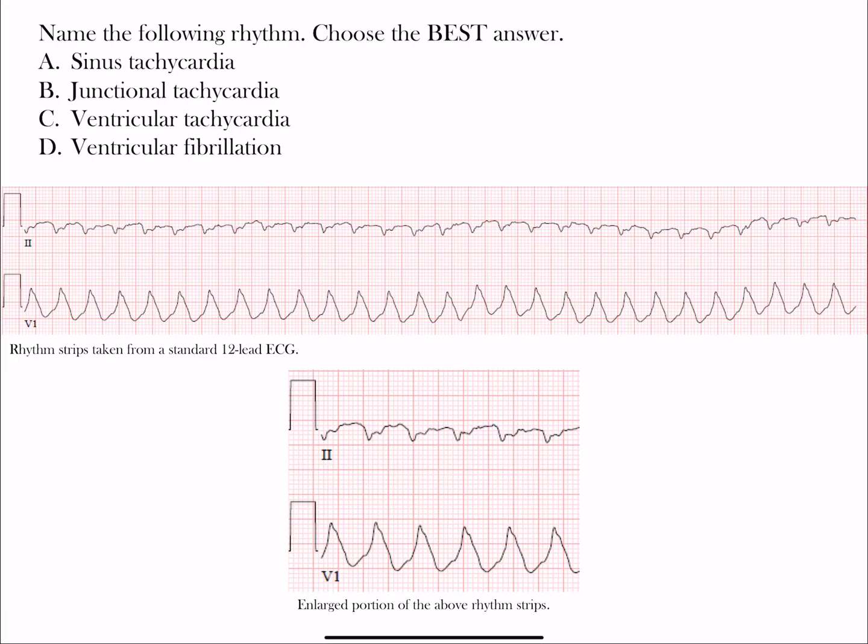Welcome to our next rhythm challenge. Here we have a rhythm - name the following rhythm and choose the best answer. We have four answer choices: A) Sinus tachycardia, B) Junctional tachycardia, C) Ventricular tachycardia, or D) Ventricular fibrillation. Four different choices and we have two different rhythm strips we're looking at here.